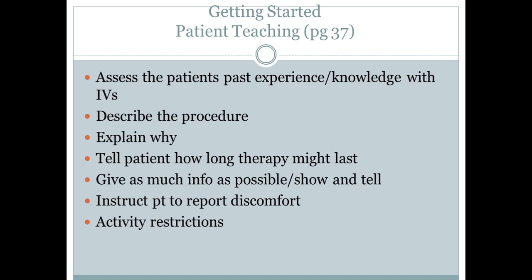You want to have a patient that is not going to look at this as a bad experience. I don't know anybody who says it's a good experience having an IV, but you definitely don't want to scar them for the rest of your life and be that one nurse that they always talk about in future hospital stays and IV starts. So you want to ask them, again, have you had an IV before? And if they say no, then discuss what it is. Many people, just through their basic knowledge, think that that needle that you use to introduce the catheter into the blood vessel stays in the vein.